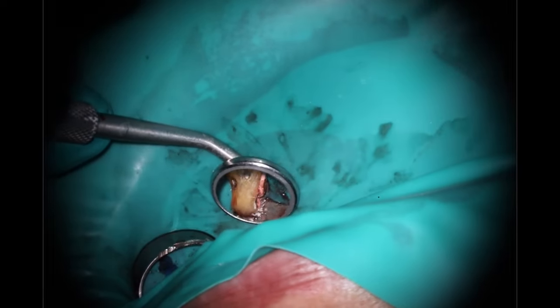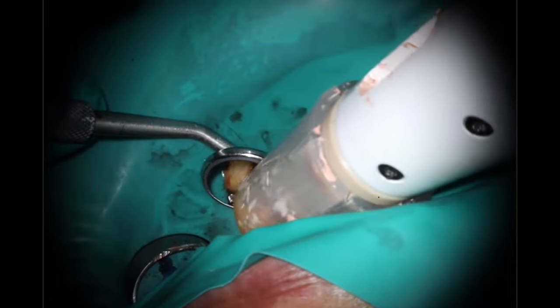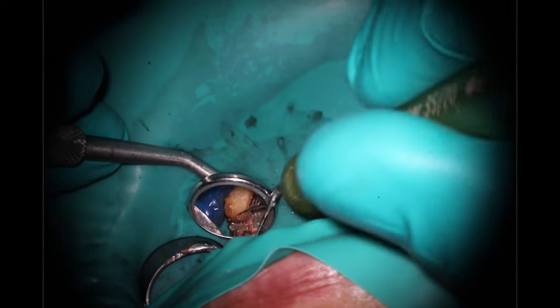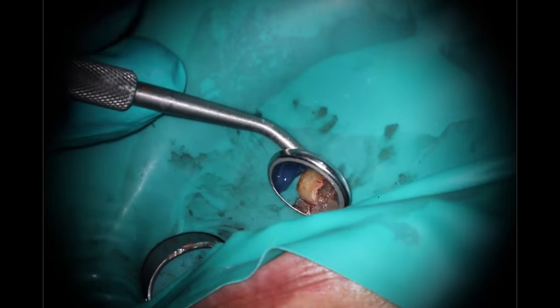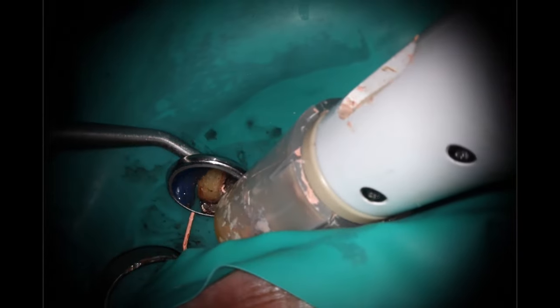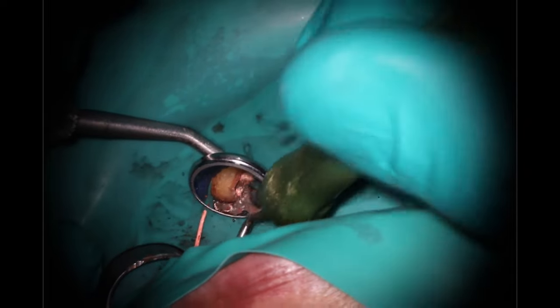I'm okay if I'm within about a half a millimeter of the working length for any time I do warm vertical — this is going to speed it up a little bit because this is hard to get into this area. I use the B&L alpha tip at 230 degrees to remove the coronal aspect. And really I'm doing a single cone technique here. I probably could have used BC high flow — that would have worked in this case — but I already had the H-plus out, so I was going to go with that instead.